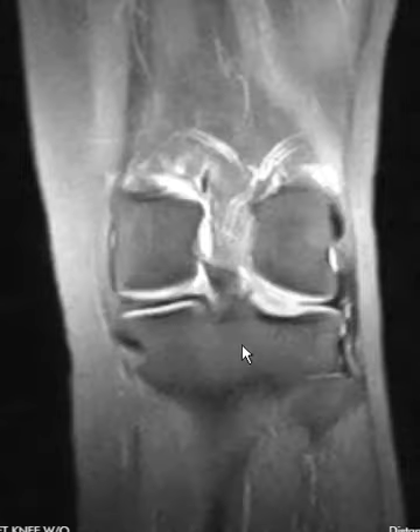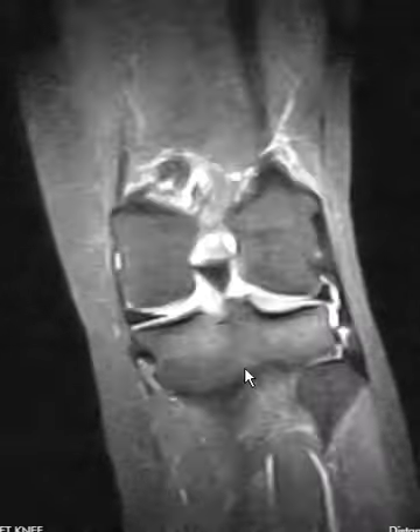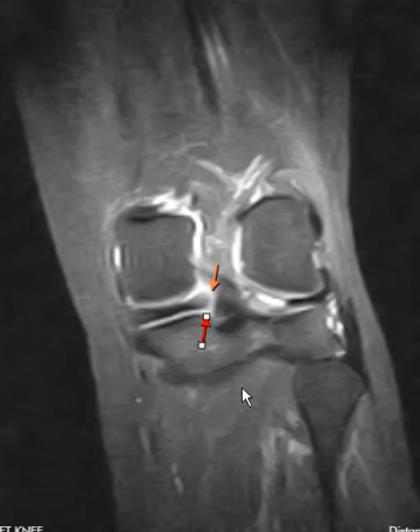If we put up the old study it becomes apparent that it's definitely real. Here's the old study — you can see how it comes sideways horizontally across and comes down, so a nice well-defined meniscus root on the old one. Again, on the new one you can see that root tear.